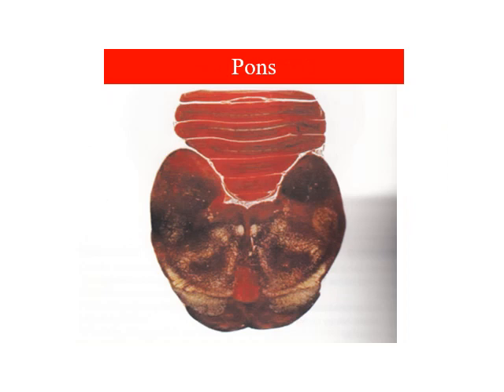Here is the pons. I cannot see any central canal. This is the fourth ventricle. Maybe you cannot see this, which is a part of the cerebellum. Okay. Here are the inferior cerebellar peduncles. Okay. And this is the basis pontis that contains the transverse pontine fibers.